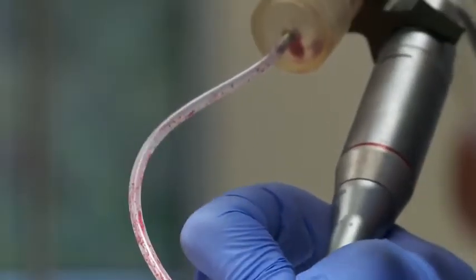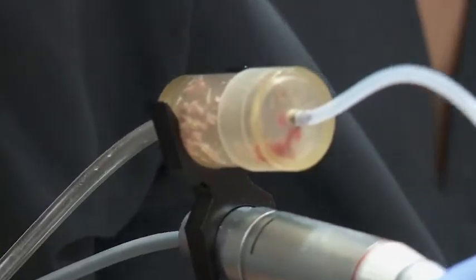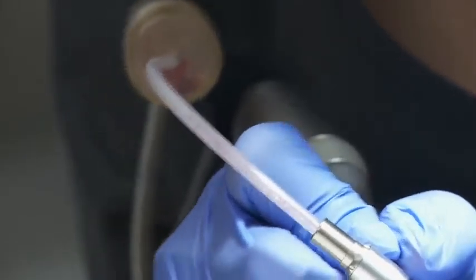A Neograft has a suction device usually attached that helps the doctor pull those grafts out, which is slightly different from some other FUE devices where you would take those grafts out one at a time yourself — either the physician or somebody on their OR staff. Some physicians don't believe the suction does any damage to the grafts, but some physicians don't like that suction device because they worry it is desiccating or drying out the individual grafts, which would prevent their growth.